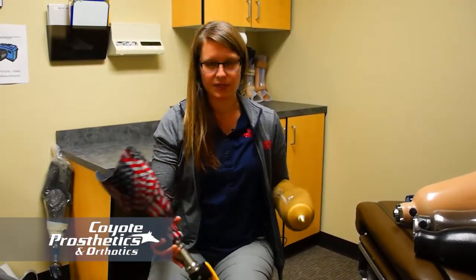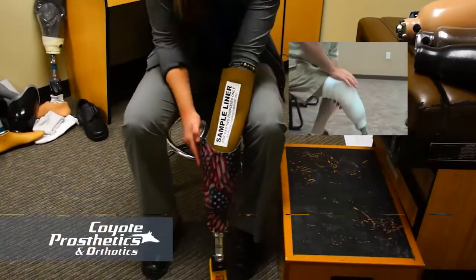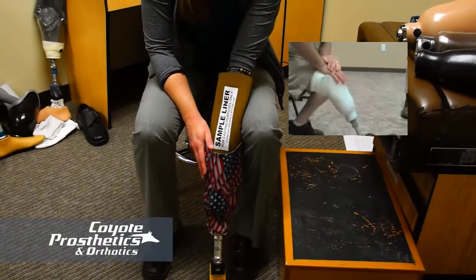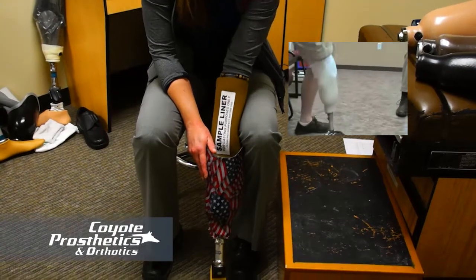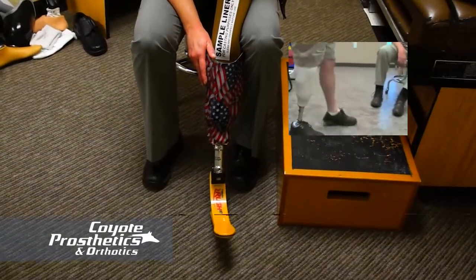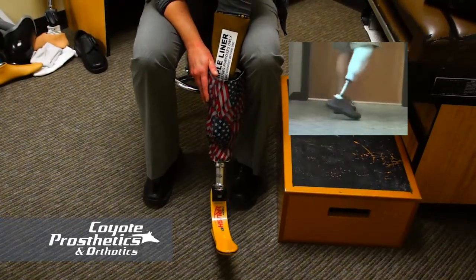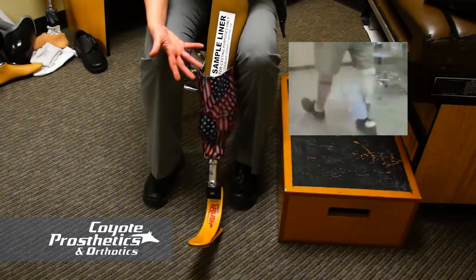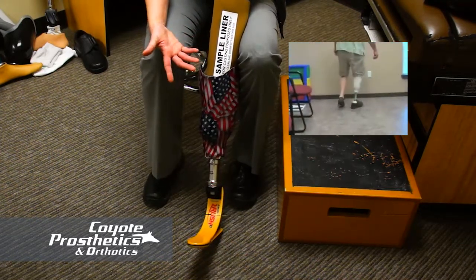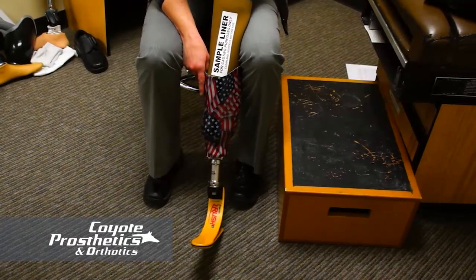When you put your prosthetic on, sometimes it can help if you put your leg into it, and then push on just the heel part and leave the toe up, which can give you a little bit more leverage. You'll want to hear clicks that are one at a time to begin with, like that. And then you want to make sure you have 3 clicks. Once you have 3 clicks, you're okay to stand up and walk on it. The pin is not fully engaged in the lock at that point. However, that's safe enough to get started.